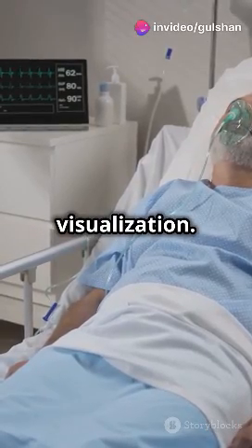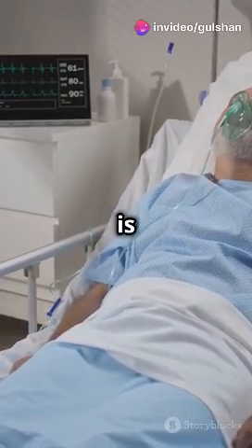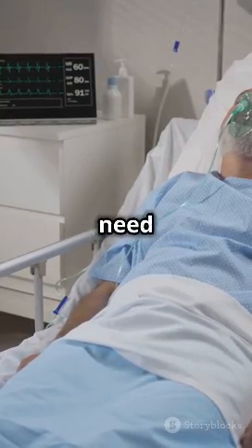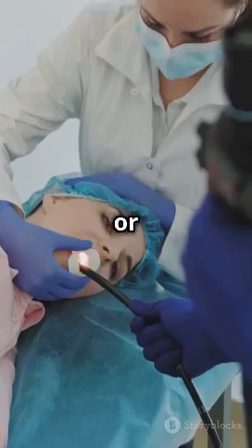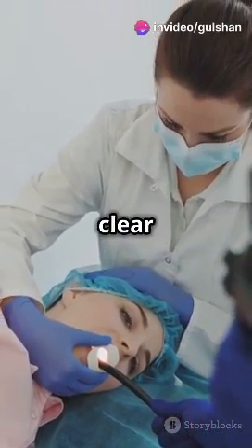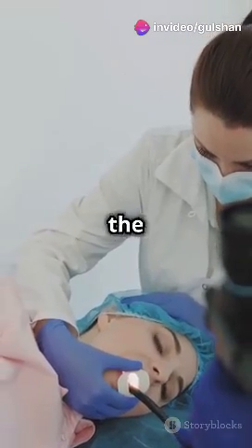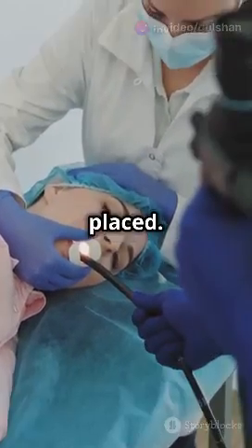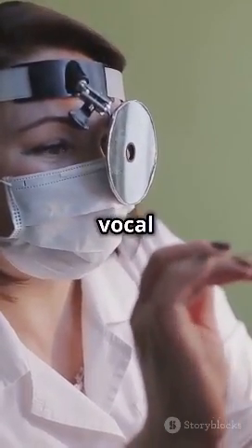Next, visualization. Visualization is key in intubation because it allows the healthcare provider to see the structures they need to navigate. A laryngoscope or a video laryngoscope comes into play. This tool is essential for getting a clear view of the patient's vocal cords and the upper part of the windpipe, which is where the endotracheal tube needs to be placed. This handy tool helps us see the vocal cords.